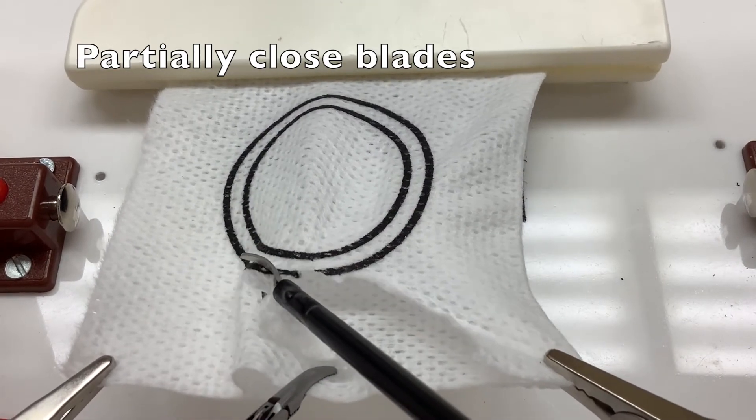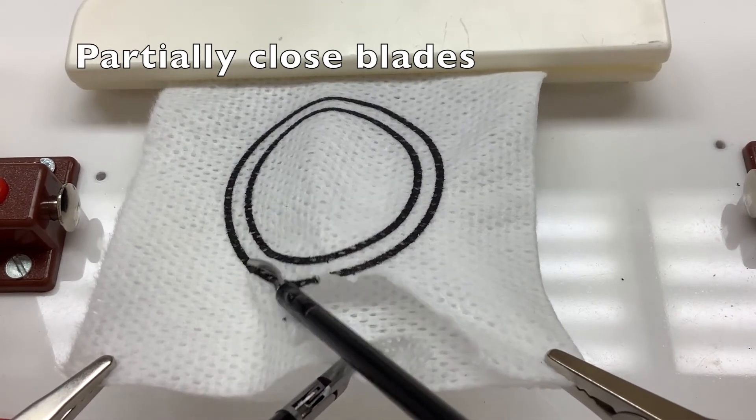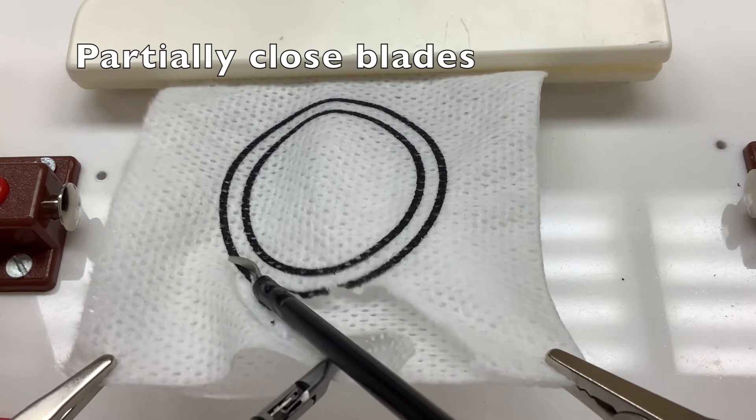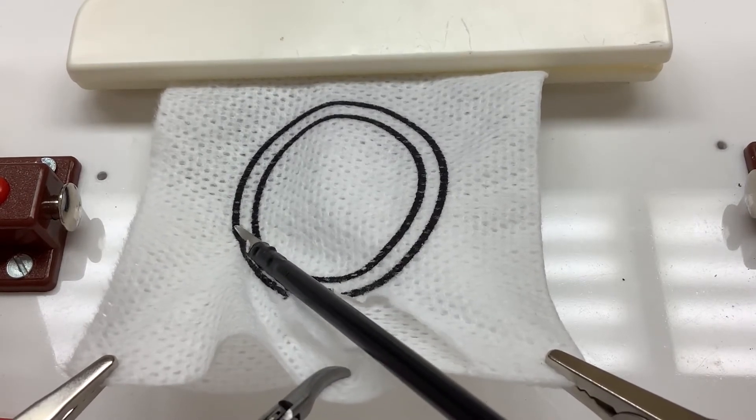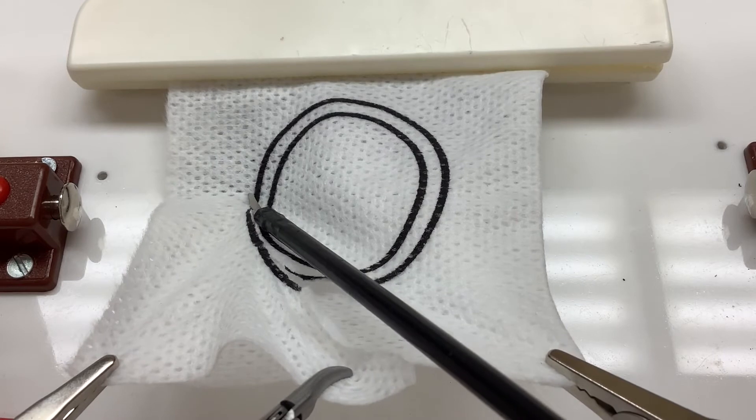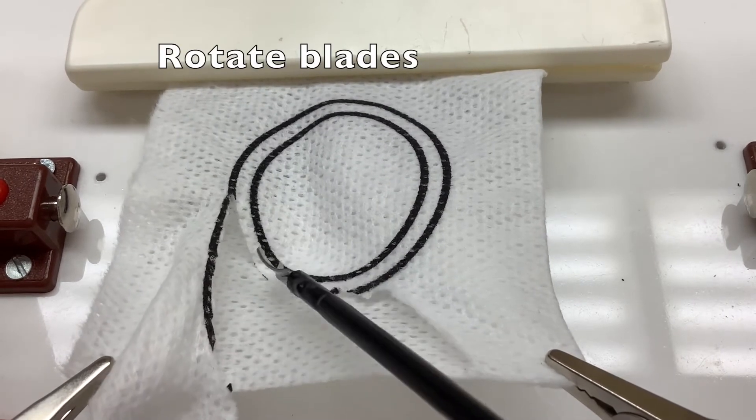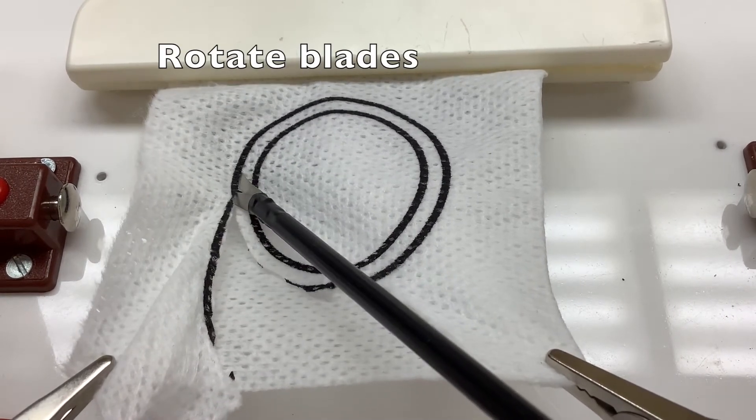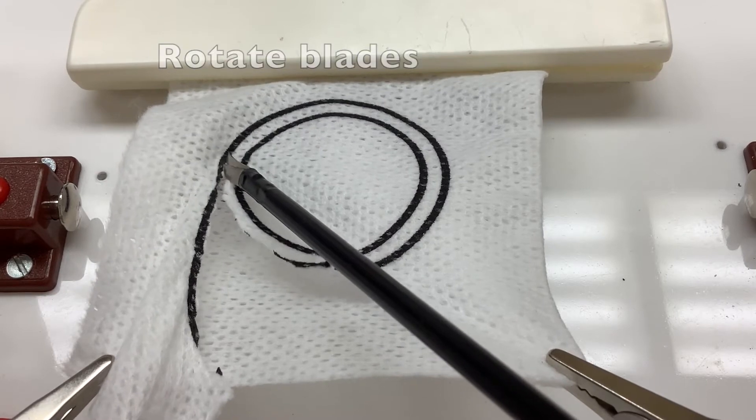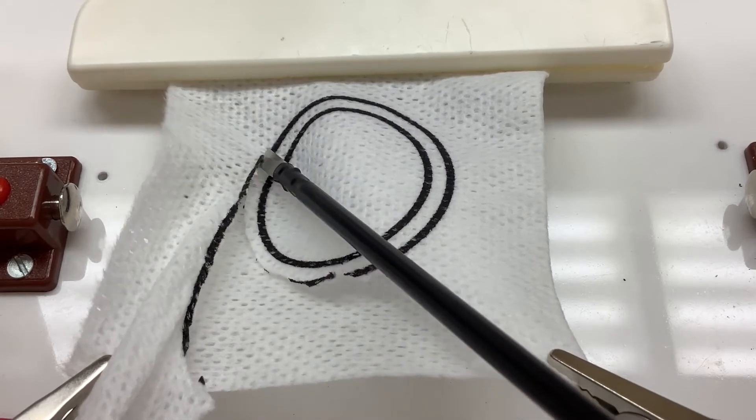Fully closing the blades causes the displacement of the scissors and results in jagged edges. The grasping hand plays an important role in maintaining proper tension in order to effectively cut. Also, use the grasping hand to manipulate the gauze and achieve ideal cutting angles.